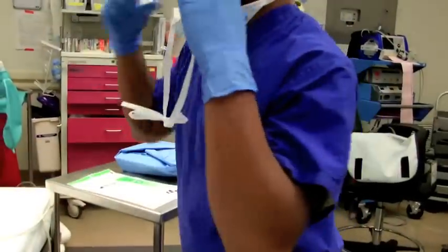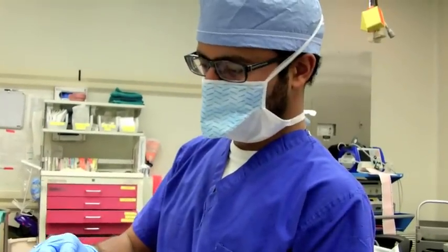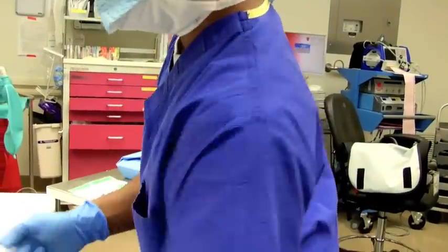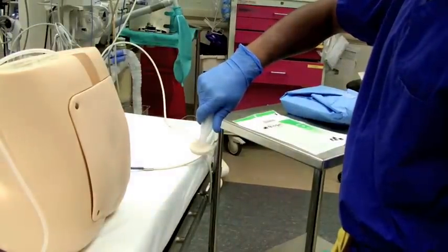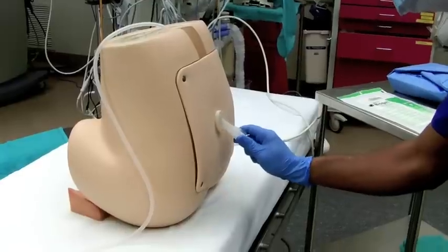I'm going to put on my surgical mask, open my ChloraPrep, and in concentric circles, clean off the patient's back.